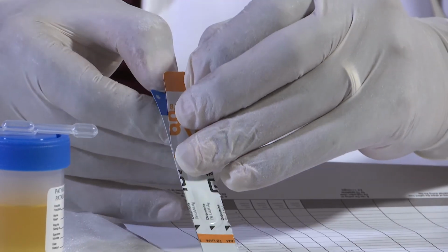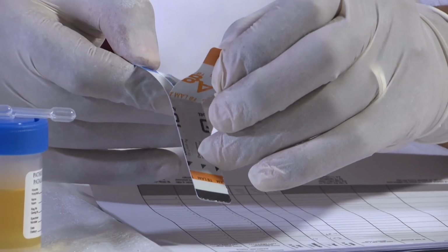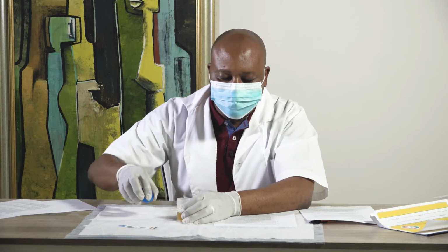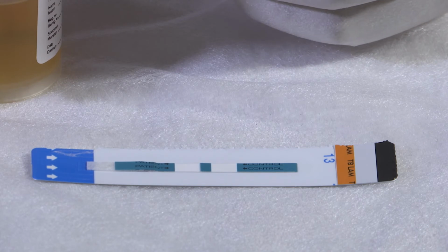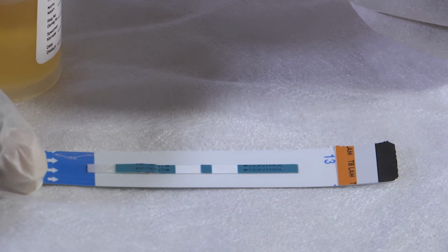Peel off the protective foil cover from the test and set it aside. Please note that once the protective foil has been removed, the assay should be initiated within 2 hours. Using the already calibrated pipette, you apply 60 microliters of sample urine or 2 drops of urine. These you apply to the sample pad. Now, the sample pad is a white pad that is marked by the arrow symbols. Here are the arrow symbols.